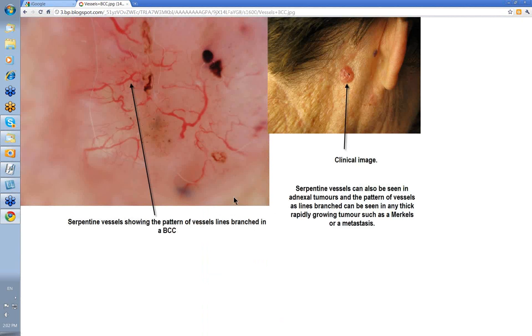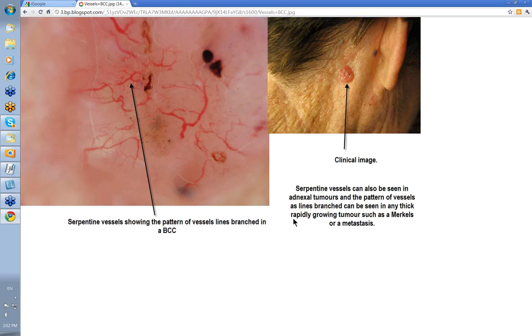Here are perhaps the more typical vessels you're going to see in your basal cell skin cancer: the serpentine vessels with a linear branching pattern. You've got some brown dots, some blue clods — probably a little bit of hemorrhage here. Remember these serpentine vessels can also be seen in adnexal tumors, and the pattern of vessels as line branched can be seen in any thick rapidly growing tumor such as a Merkel's or a metastasis. Vessels as lines branched isn't always a basal cell skin cancer, but when you've got some of these additional features, this allows you to make your diagnosis of BCC.